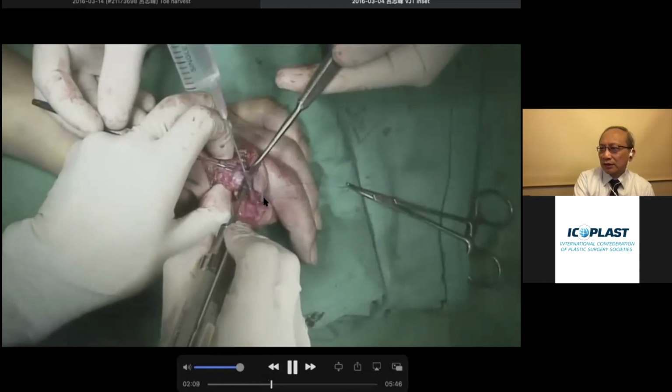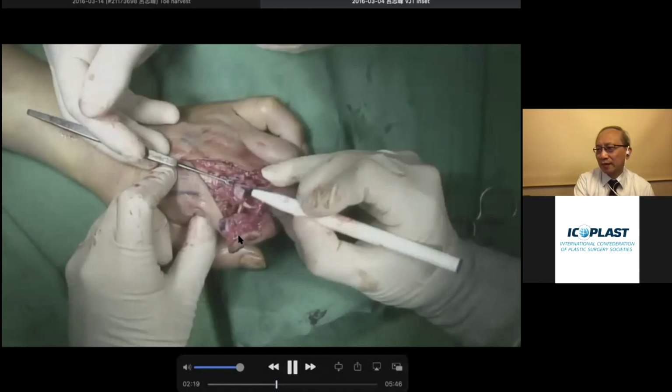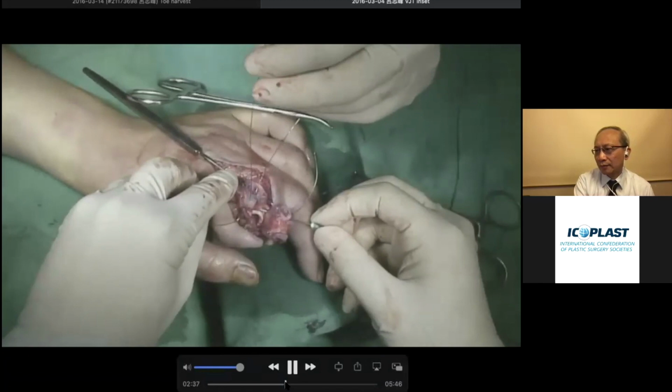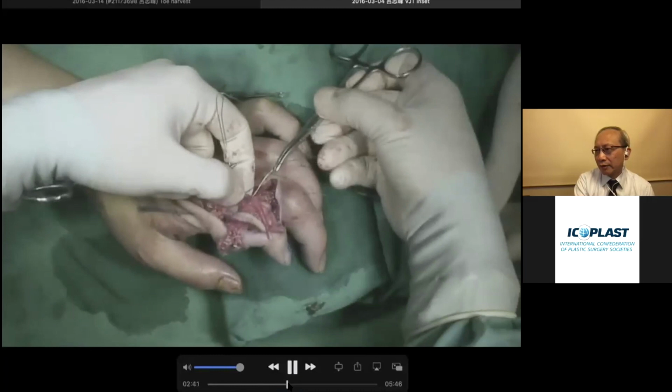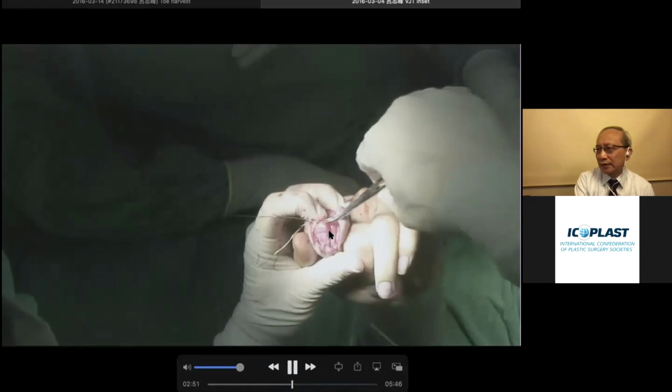So a little bit too much, some spur here, then I try to burr it out. Alignment is okay, then yep, axis again, osteosynthesis. So using the wire again. Wire again. So after we fix, we have to check the alignment. So when it flexes, make sure that the rotation is okay.